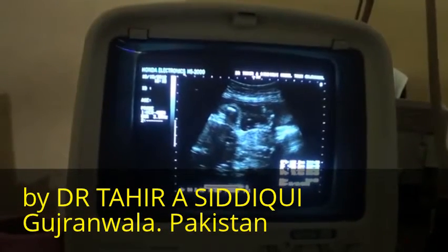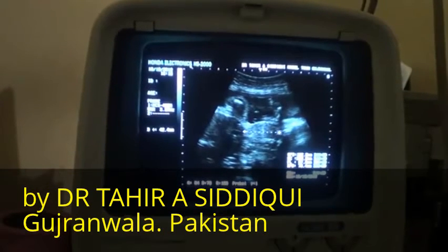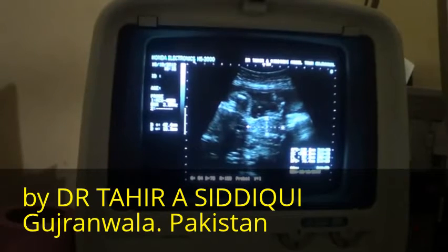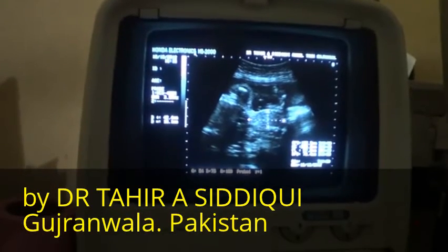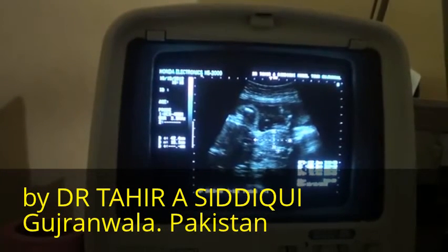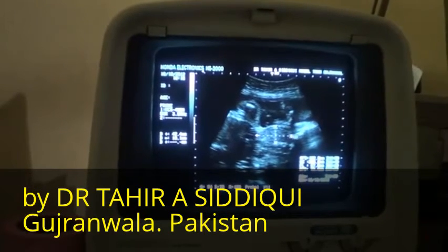This is a mass measuring approximately 4.2 by 1.91 centimeters. This is the neck of the fetus, and from here you see this is the cranium.